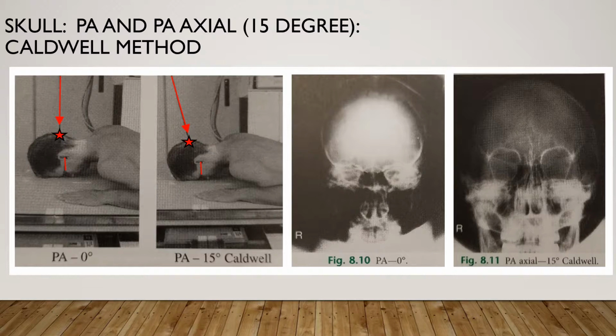For both of these x-rays, I'm going to have the patient hold their breath. I probably won't tell them to take in a big breath and hold it. I will just say stop breathing, because if they're breathing, then they'll go ahead and move. I'm not worried about air coming in, coming out. I'm just making sure that they're not moving.